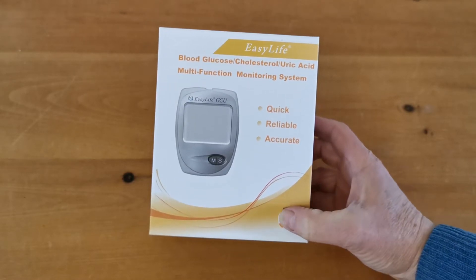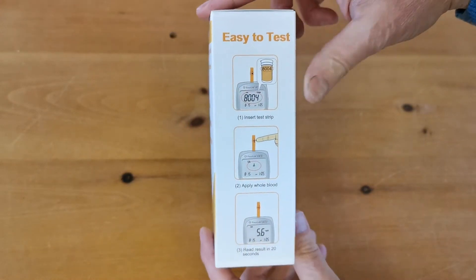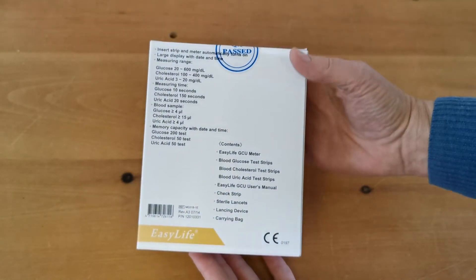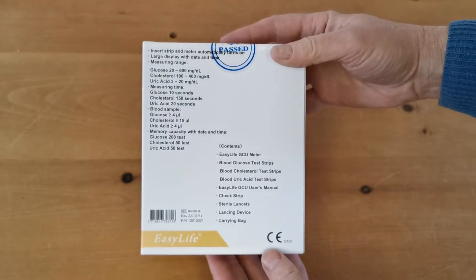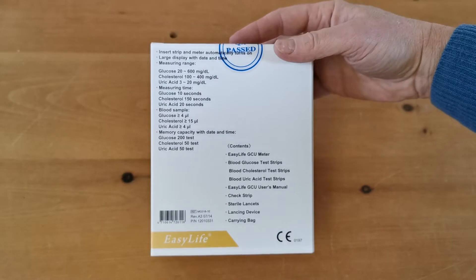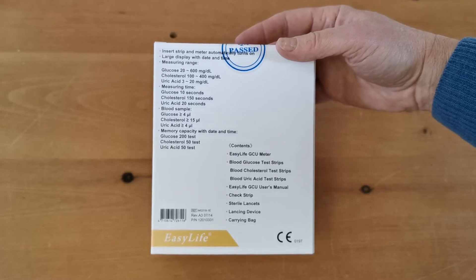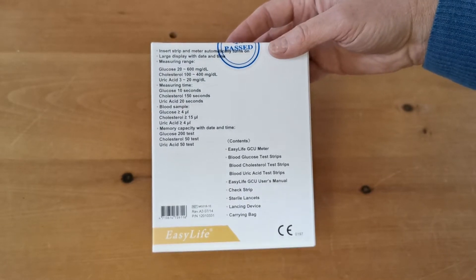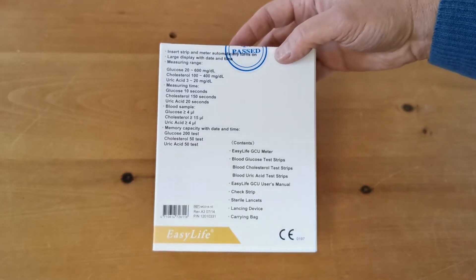First, we'll show you what you get when you buy the packet. The outer packet has simple, easy-to-read testing instructions on the side, a contents list on the back. Inside you have the triple meter, a small supply of glucose test strips, cholesterol test strips, and uric acid test strips, the user manual, a check strip or code chip that goes in the top, a supply of sterile lancets, a lancing device, and a carry bag.